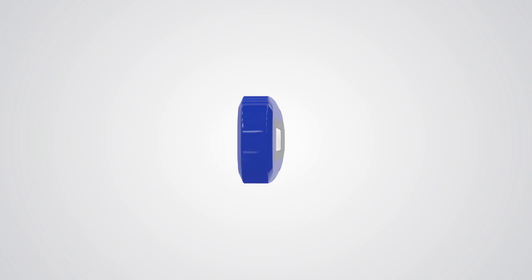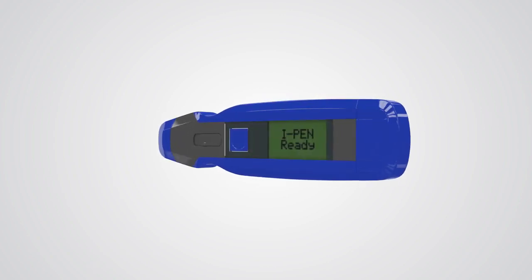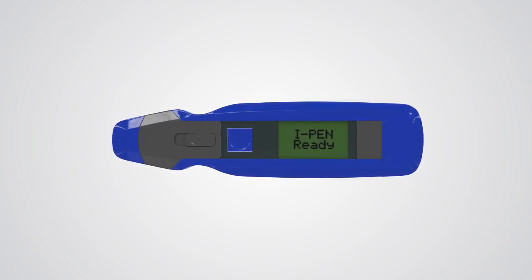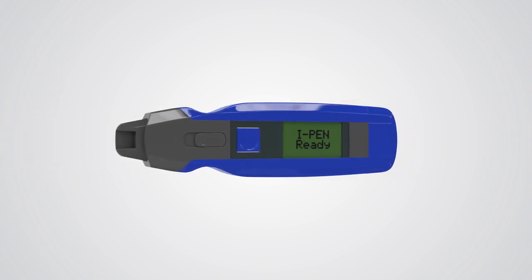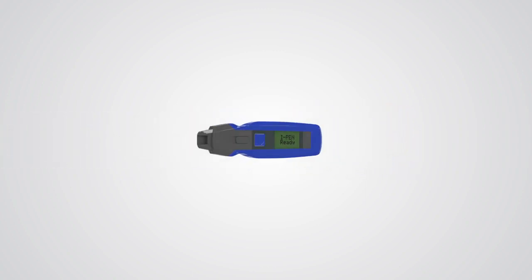Using state-of-the-art technology, the iPen provides a quick and accurate quantitative measurement of osmolarity of human tears in normal and dry eye disease patients by analyzing the tear-soaked tissues in contact with the tear film.